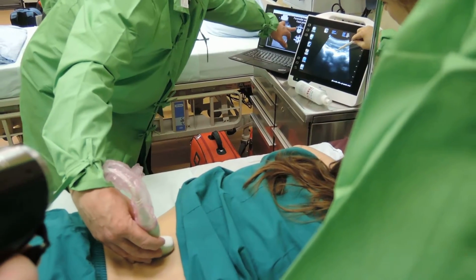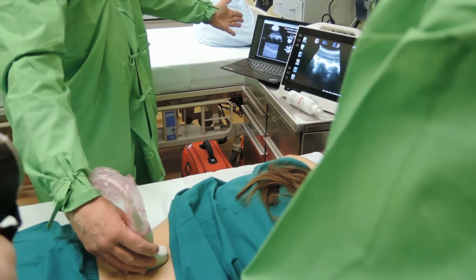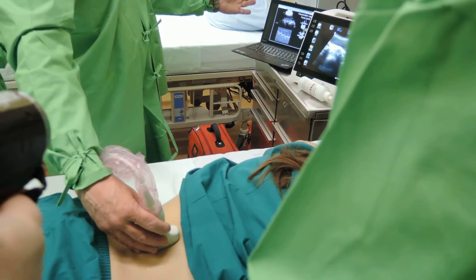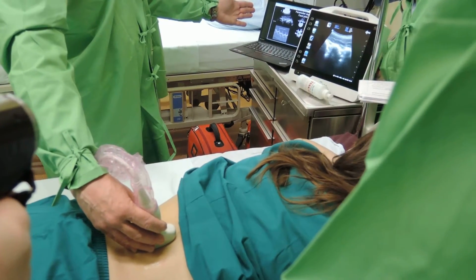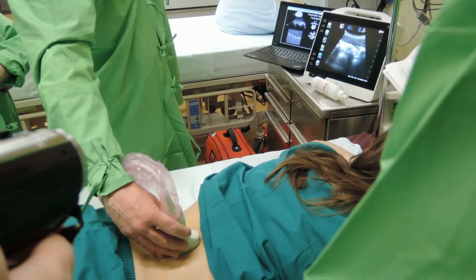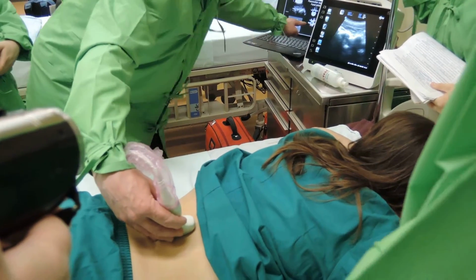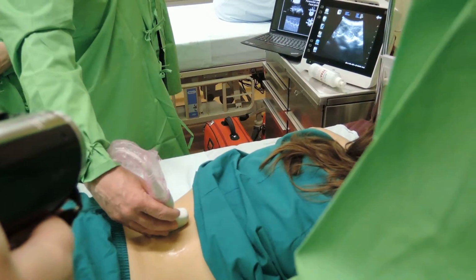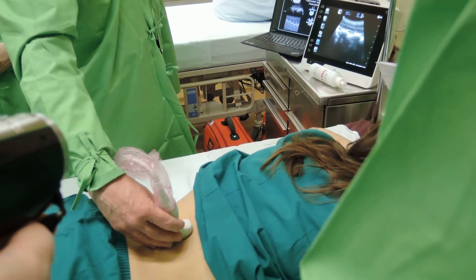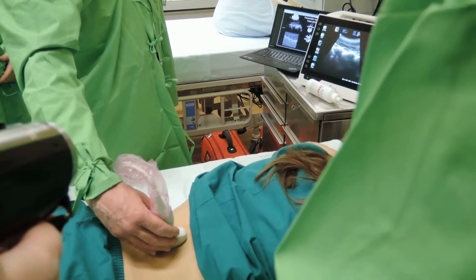And there's the facet joint itself. There's a schematic drawing showing where we are with our probe. We simply moved a little bit more towards the midline. When we move back from the transverse processes toward the midline, we reach the level of the articular joints. When the professor moves more laterally, we again start to see the transverse processes, and more medially, we return to the facet joints.